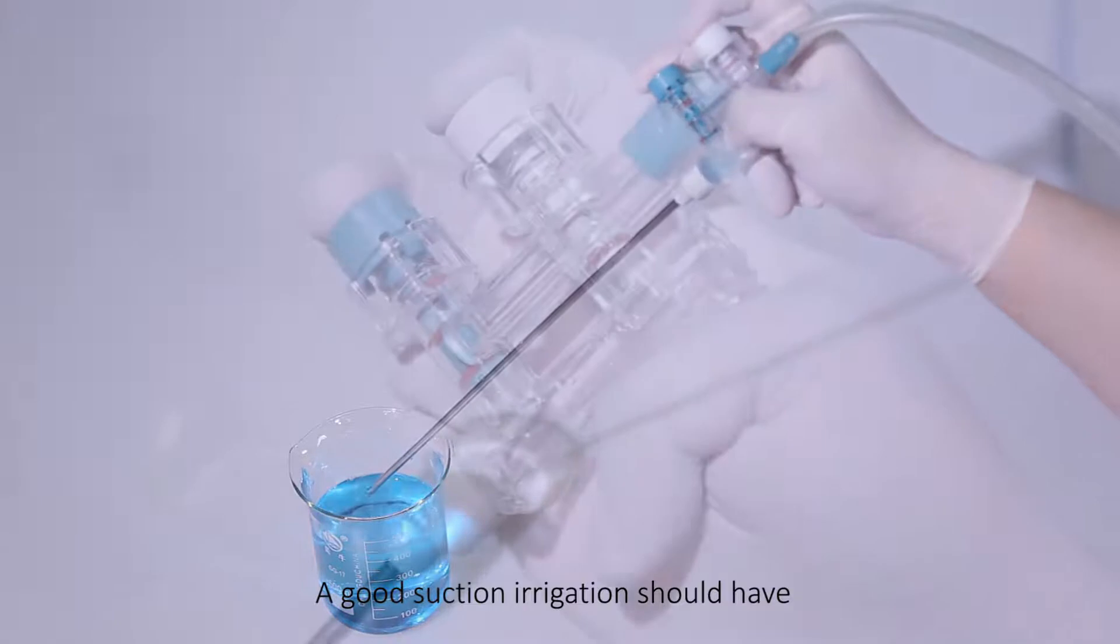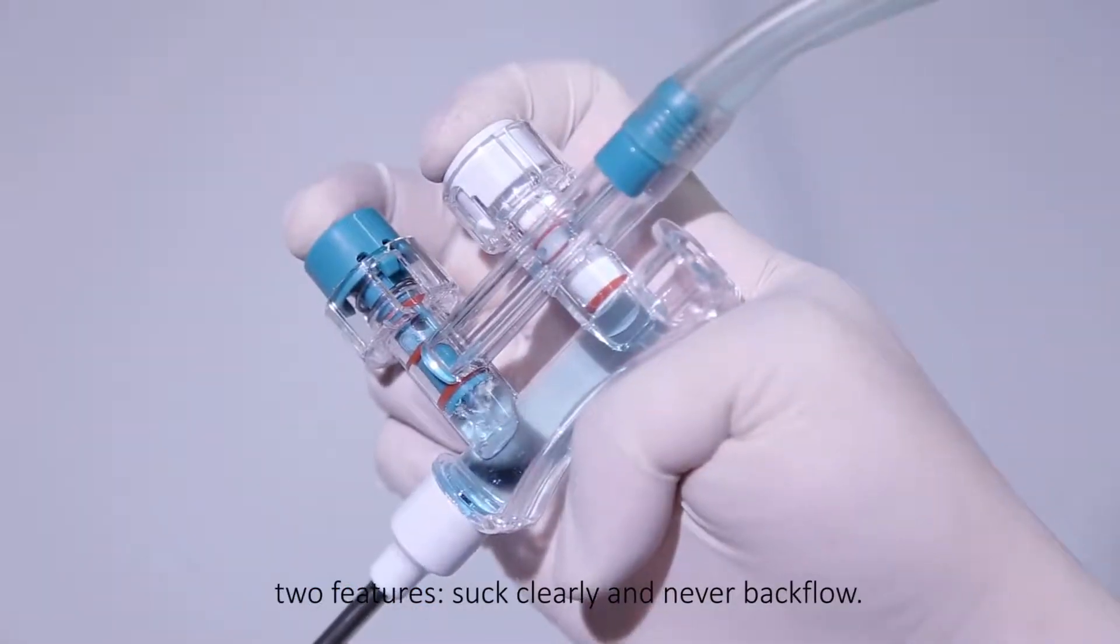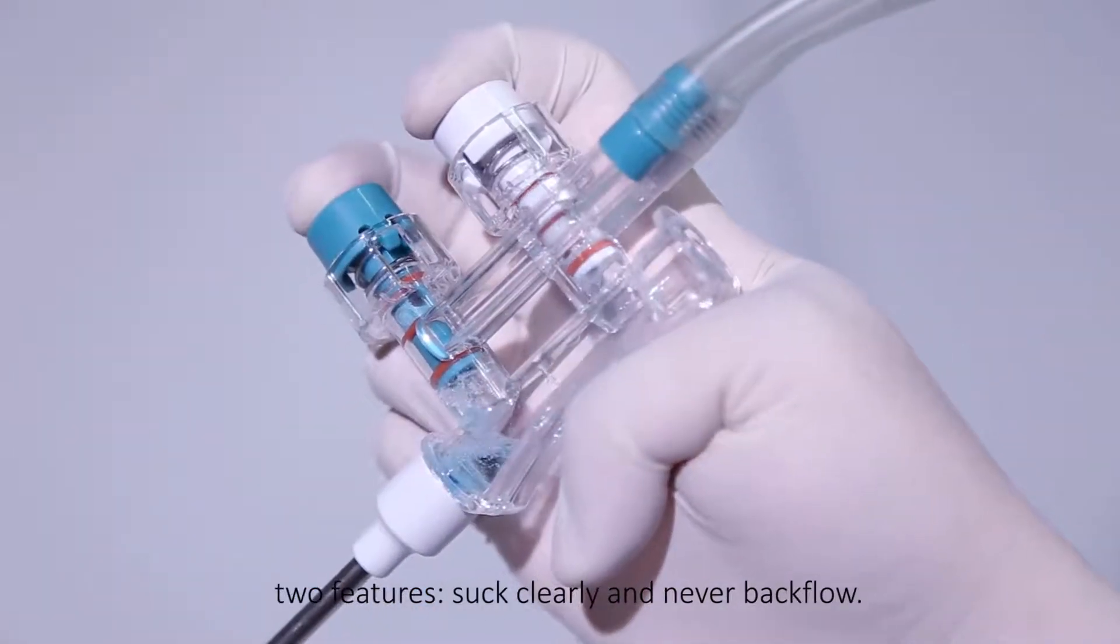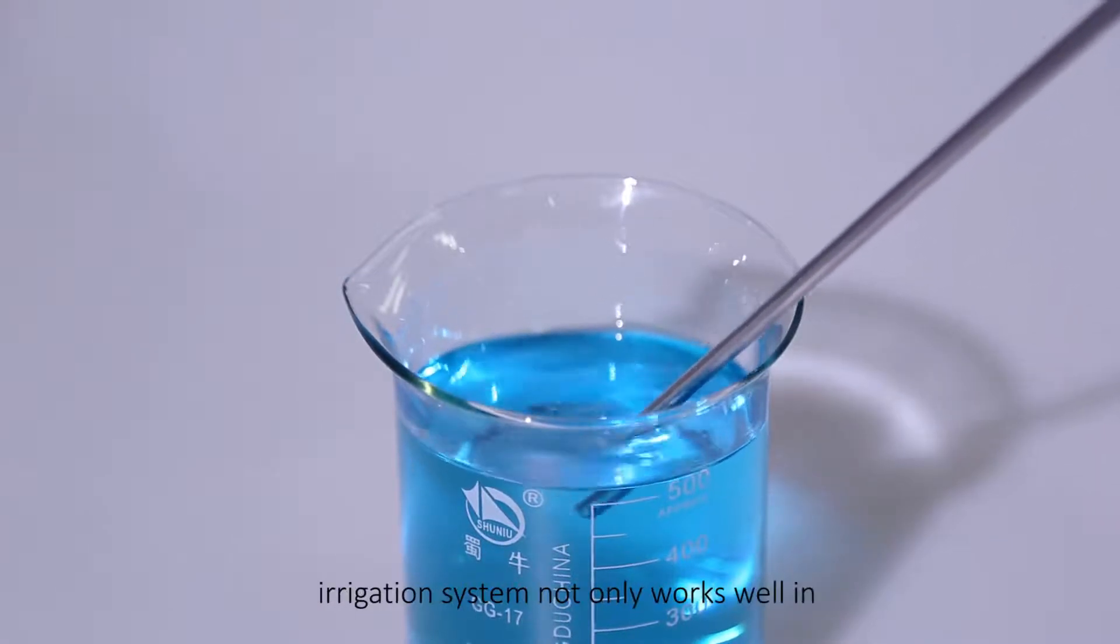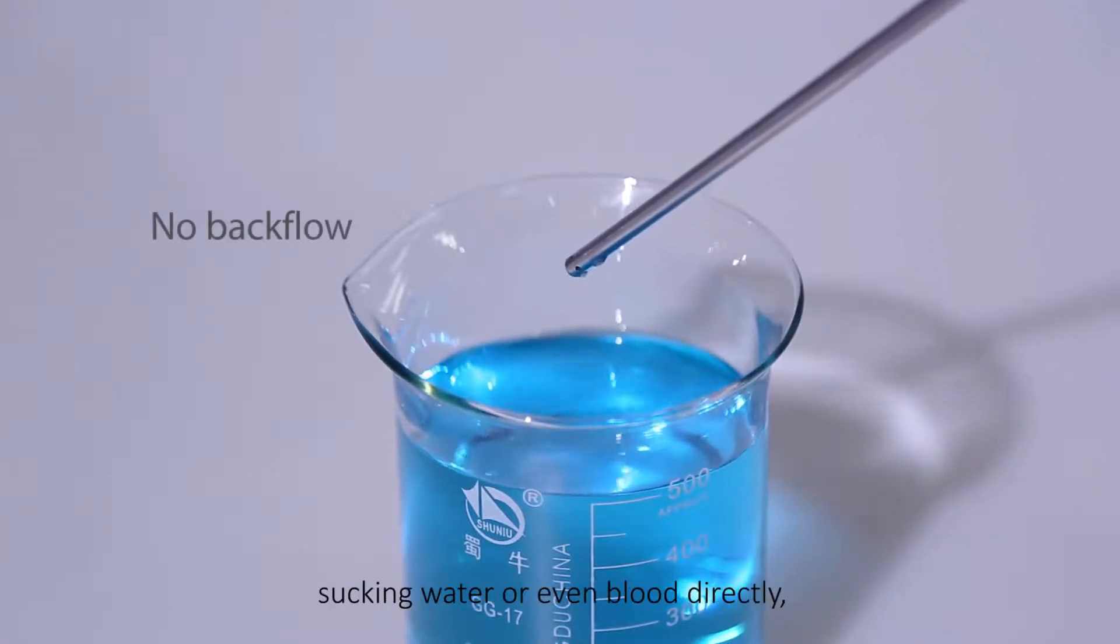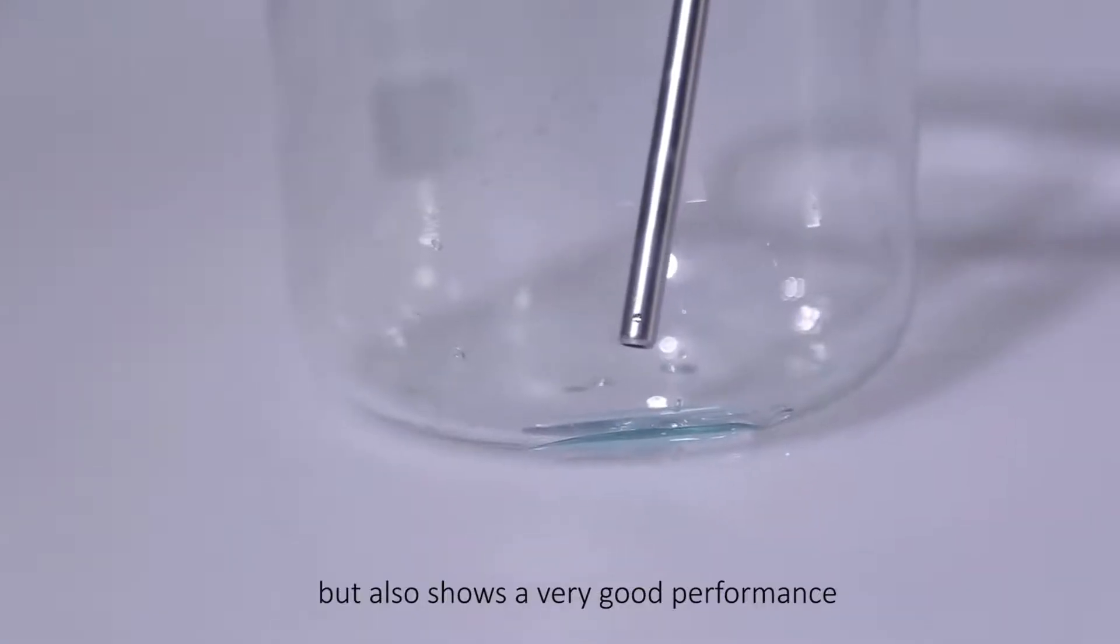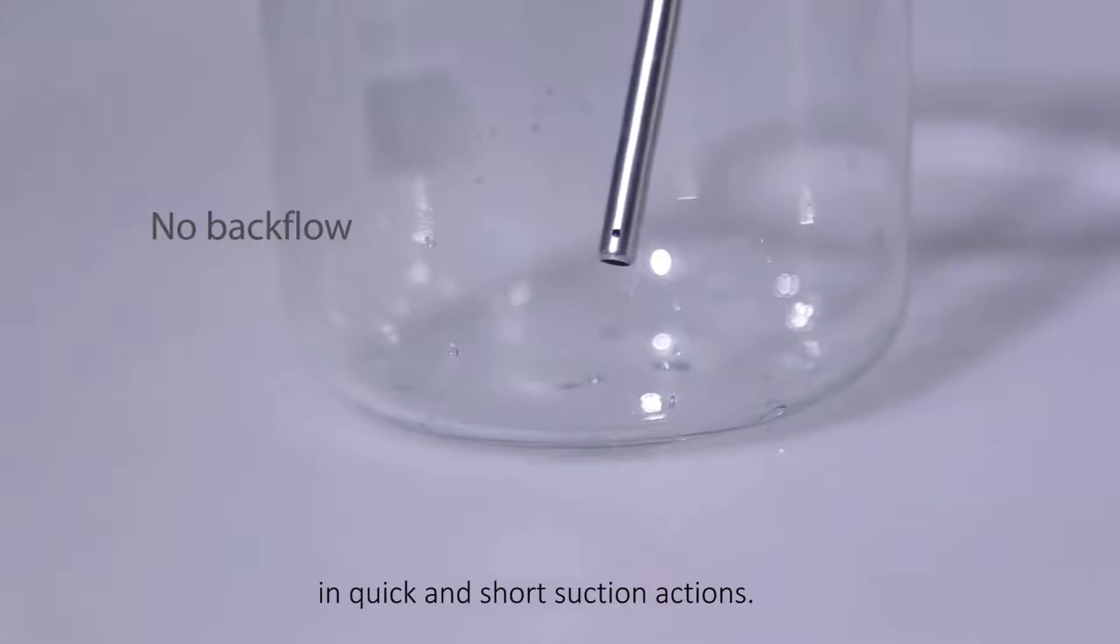A good suction irrigation should have two features: suck clearly and never backflow. The Homeport Disposable Suction Irrigation System not only works well in sucking water or even blood directly, but also shows very good performance in quick and short suction actions.